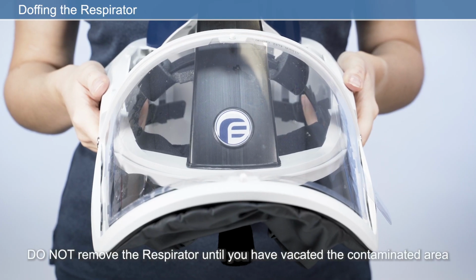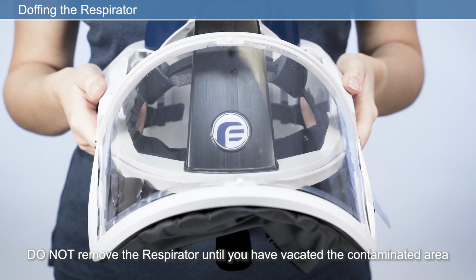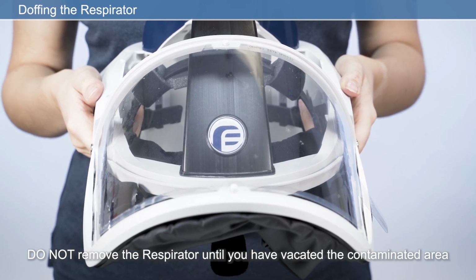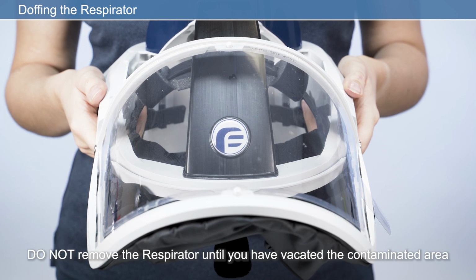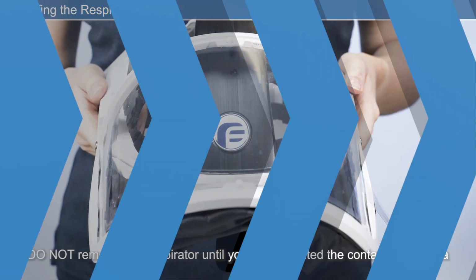If special decontamination procedures are required, take appropriate precautions and place the respirator in a suitable sealed container. Otherwise, clean the respirator as described later in this video.